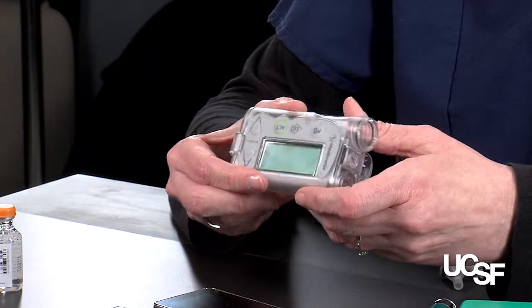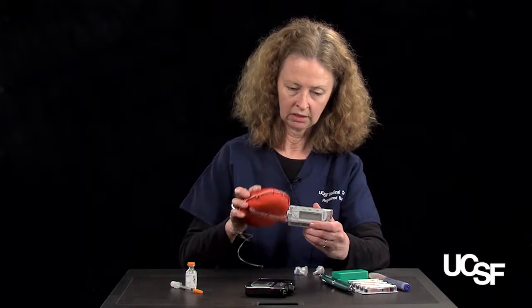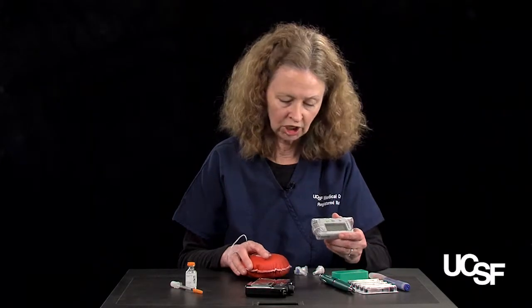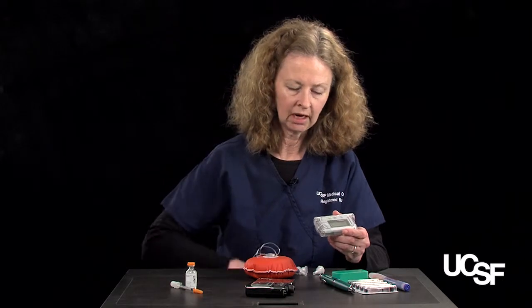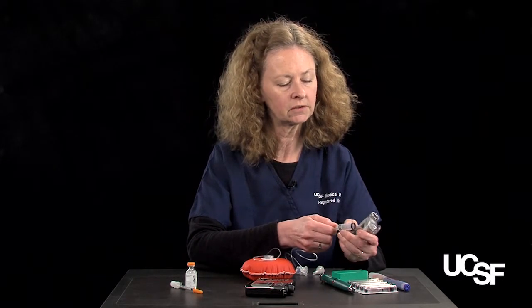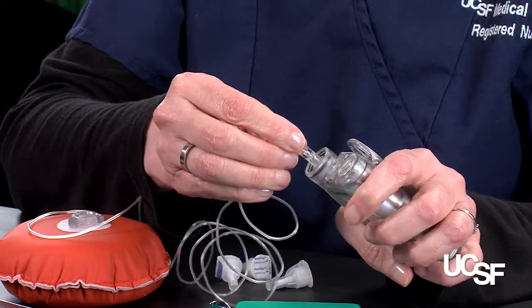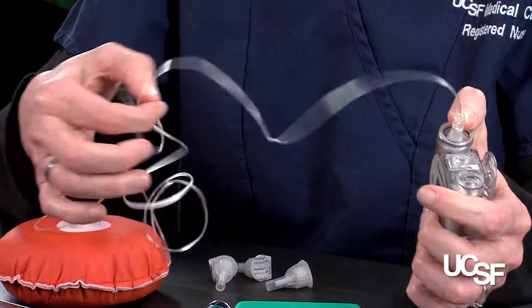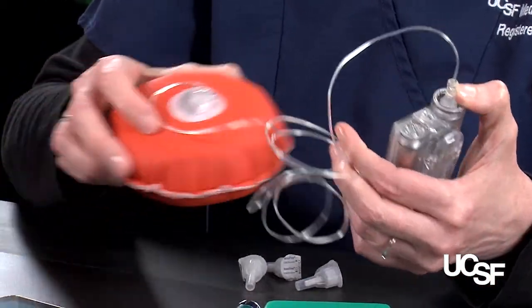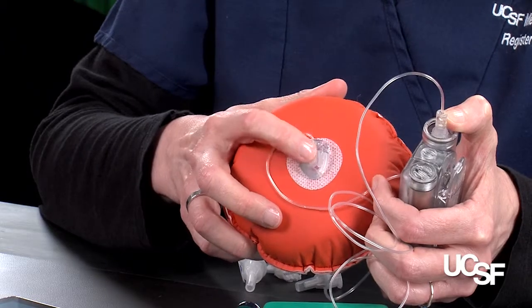So this is the Medtronic version. It is the one that can be integrated with the CGM. And how this works is that a syringe is filled with insulin by the wearer. That syringe is dropped into the pump. The tubing then delivers the insulin into the infusion set that the user also inserts into their skin.